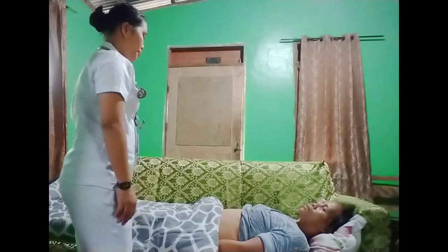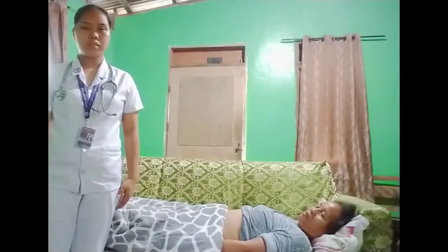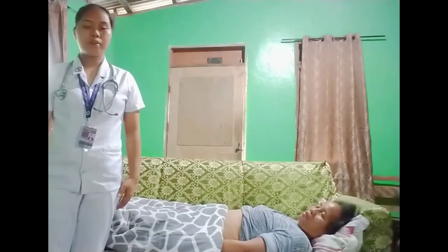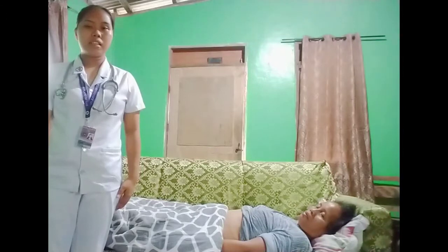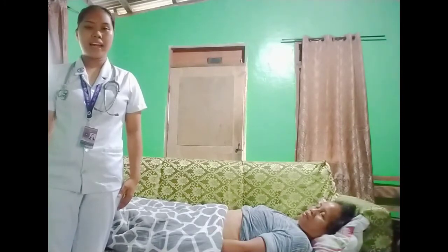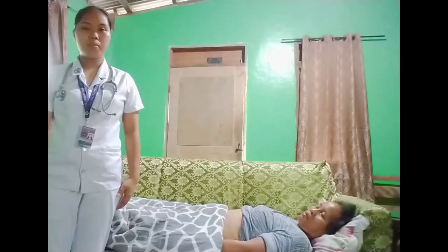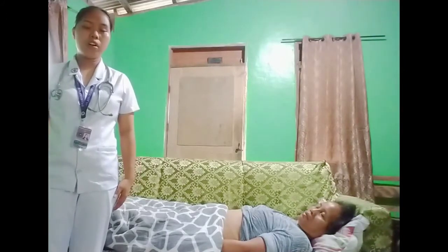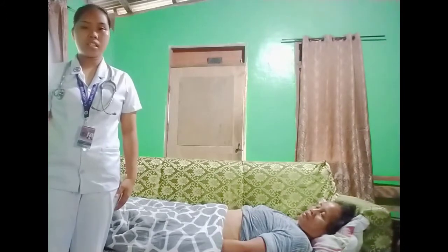Okay, thank you. Use the diaphragm of the stethoscope and make sure that the diaphragm is warm before placing it on the abdomen. This is to avoid patient tension. Apply light pressure or simply rest the stethoscope if the abdomen is painful or tender. Bowel sounds will be more active over the ileocecal valve in the right lower quadrant.